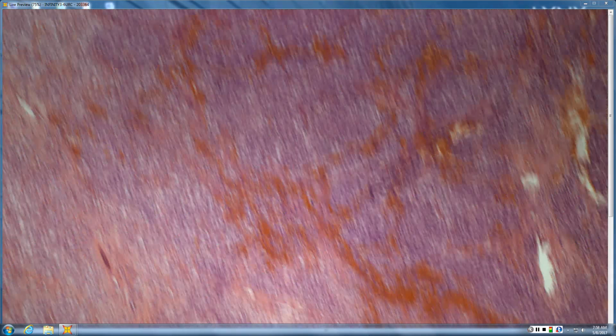No, I don't think that would be fair to have those two as choices there, because they both can have squamous eddies, they both have outer root sheath differentiation, they're both endophytic. But you nailed exactly what the differential was there. That was very good. Warts, right?